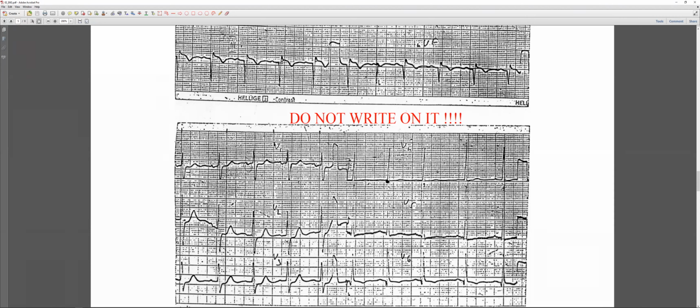Especially when you do have an inferior acute MI. What else? Posterior. Well, no, then you would see the reciprocal, so that's not posterior. What could be the sign of a posterior MI? You would see reciprocal ST depression and inverse T if there was posterior in the chest.